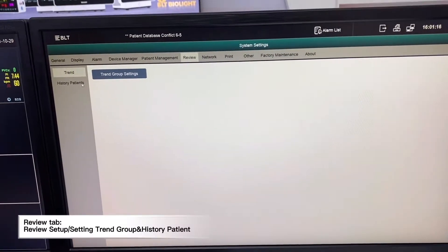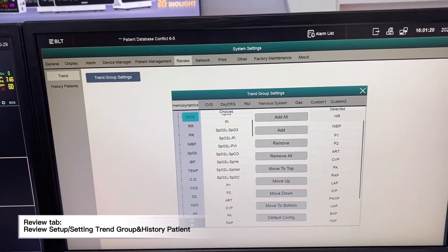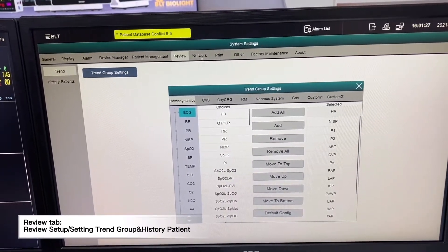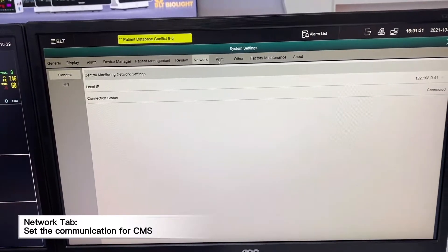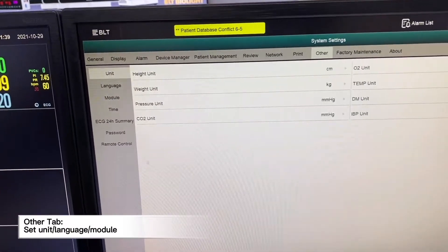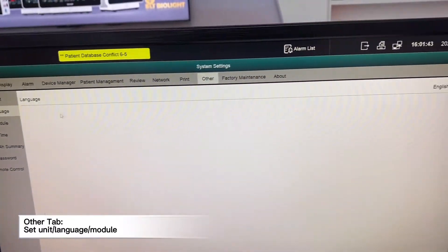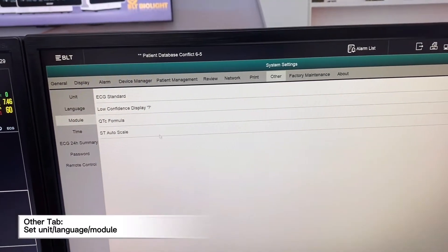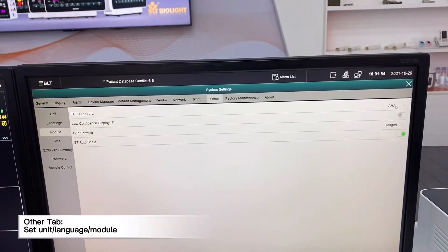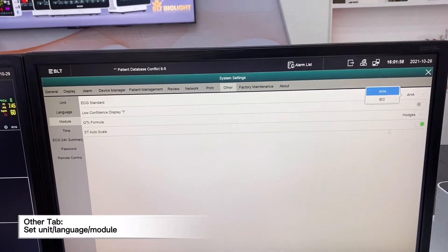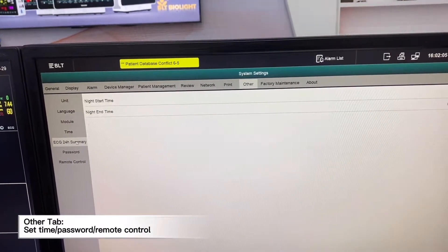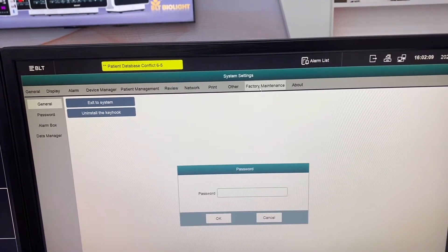We can change the patient group, and we have a review page where we can set up the review trend settings. We can also configure the network settings and change the language in the settings. We can customize modules — the first one is ECG standard, depending on which ECG standard we use, either AHA or IEC. We can also change the system time, and this is the factory maintenance section.